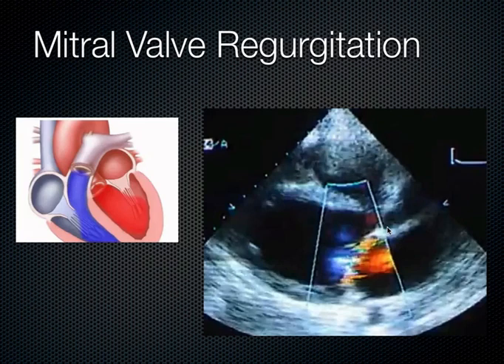Now, this is an example of the parasternal long axis, just to demonstrate where that mitral valve is. One of the things you've got to remember about Doppler, it's a little bit confusing initially, but you have to commit this to memory, is that you can't have the Doppler assessment at 90 degrees to the angle of the sound.